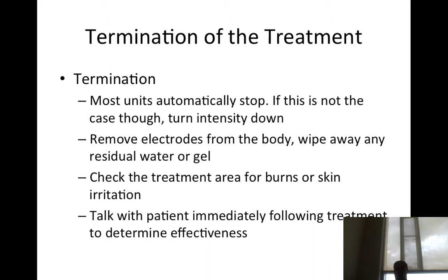from the body. Why? If the unit doesn't stop automatically and it's a unit that you actually close the circuit, when you go to pick up the pad, take the pad off the patient, and the electricity is still going through the patient, you're going to get that electricity through your finger. And it's a small surface area, and it's going to hurt. We've all done it. I've done it on patients, not thinking, doing 5, 6 different things at once. I hear a beep. I think it's that. Bam. Electricity goes through my finger.